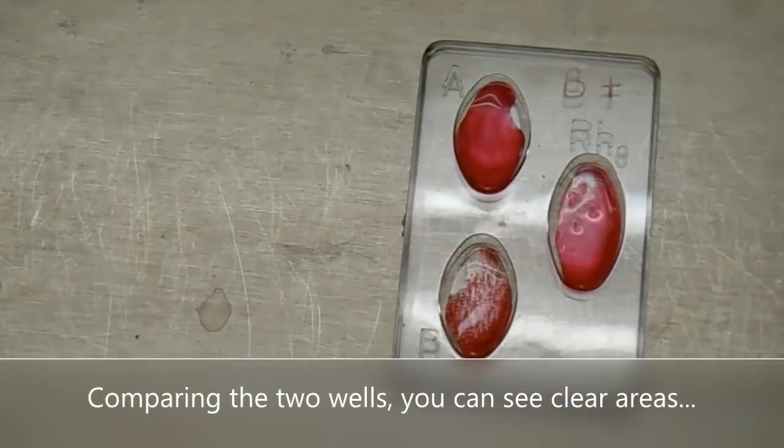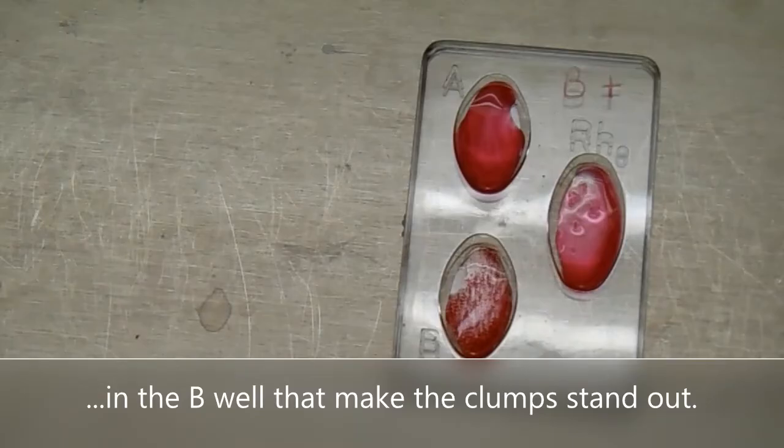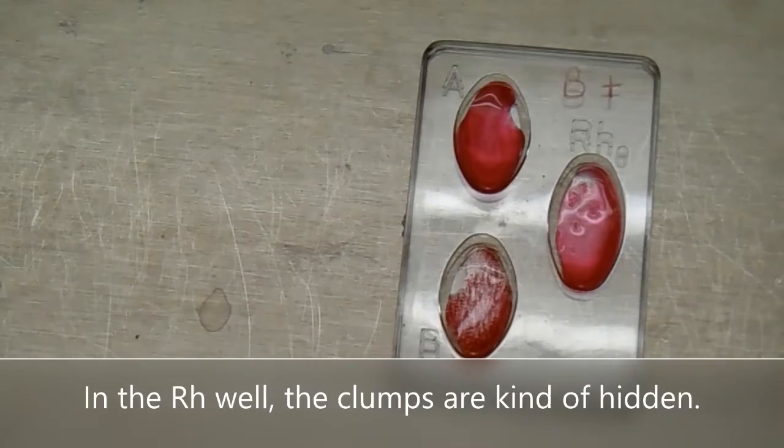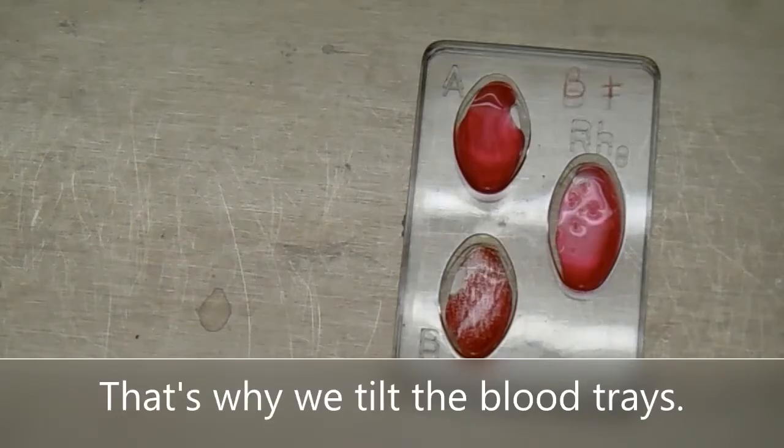Comparing the two wells, you can see clear areas in the B well that make the clumps stand out. In the RH well, the clumps are kind of hidden. That's why we tilt the blood trays.